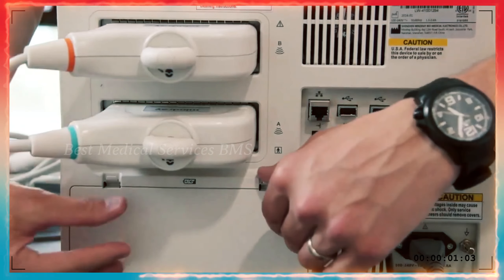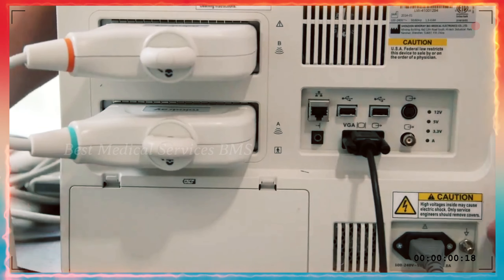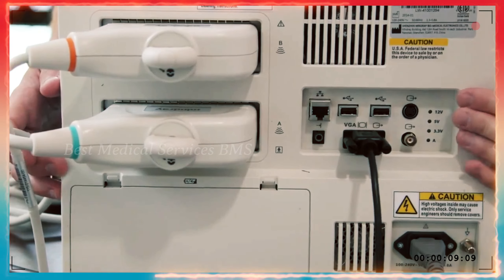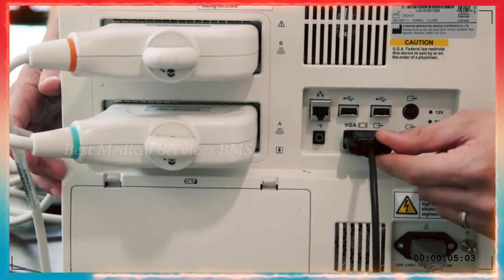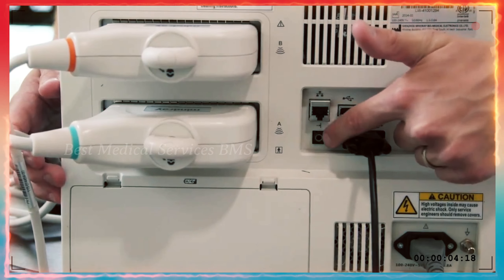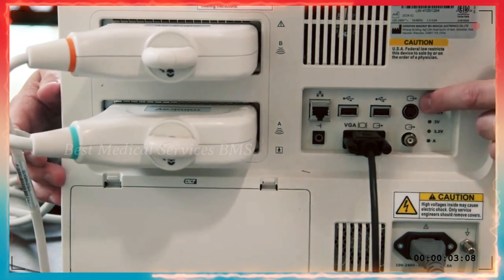On the back, you'll also see a space where the battery is. When you open up this little compartment, there'll be one battery included that fits right in. You'll also see where the power cord inserts on the back of the machine in the bottom right corner. There's also a panel with an output for a VGA cord — not included, but you can attach that to an external display. You'll also have an area to plug in a network cable, an analog printer, a couple of USB ports for thumb drives, and a digital printer out as well as S-Video.